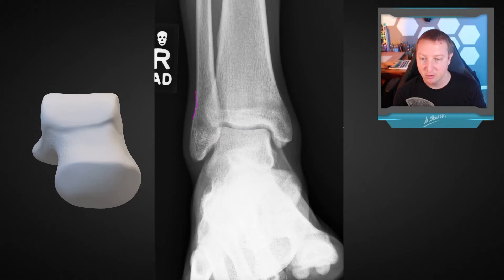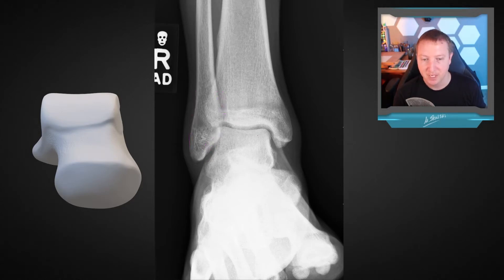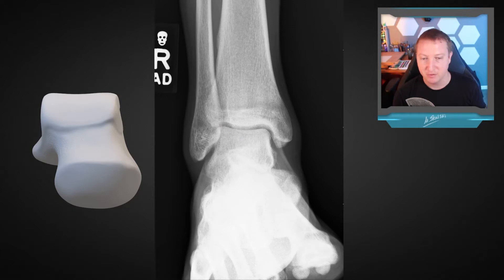The lateral malleolus gently curves with an articular portion, and then there's a ligamentous portion which scoops in. It then curves up into the syndesmotic region, which we'll see better on the medial oblique view. Similarly, the lateral facet we'll see better on that mortise or medial oblique view as well.